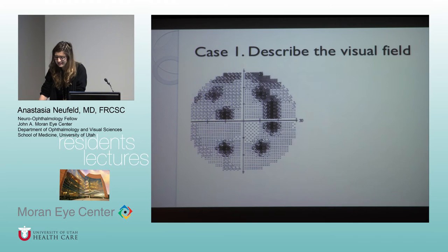Like, remember how you were taught to read an x-ray? Yes. So this is a chest x-ray. Okay. Of the right person, maybe, don't know, and what eye, you know, so what kind of visual field is this? Okay, so this is a Humphrey visual field. And what kind of Humphrey visual field is it? A central 10? Well, or, see that little 30 there on the right?